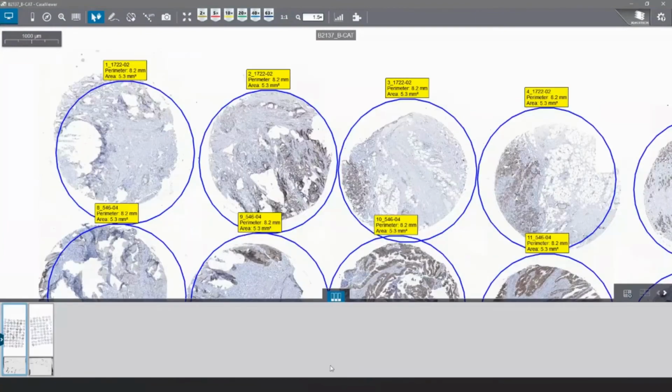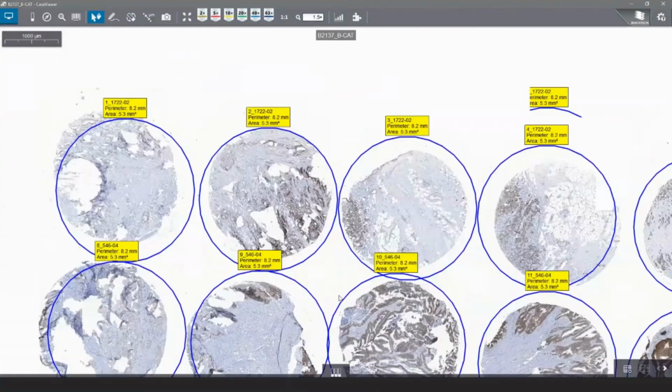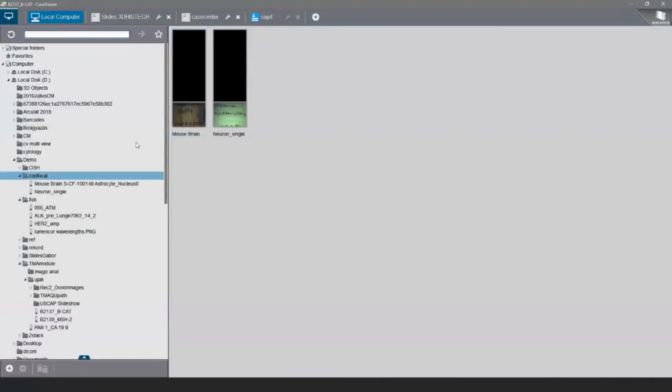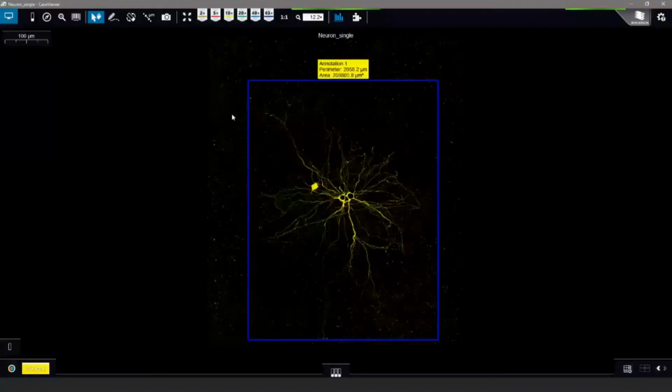Now let's move to the Z layer visualization and to the three-dimensional reconstruction. Actually, I think that this will be the highlight of this webinar, of this presentation. I have here some digital slides recorded by our unique confocal scanner. The confocal scanner is a really unique device.